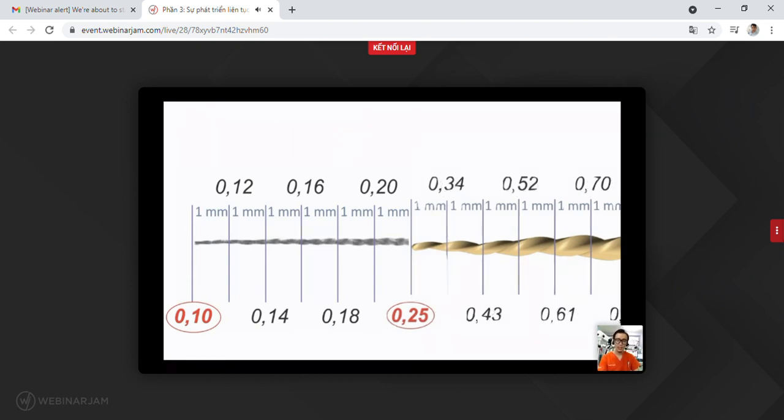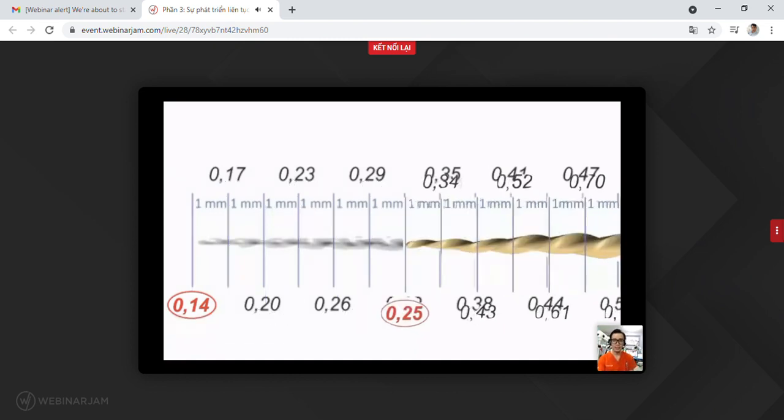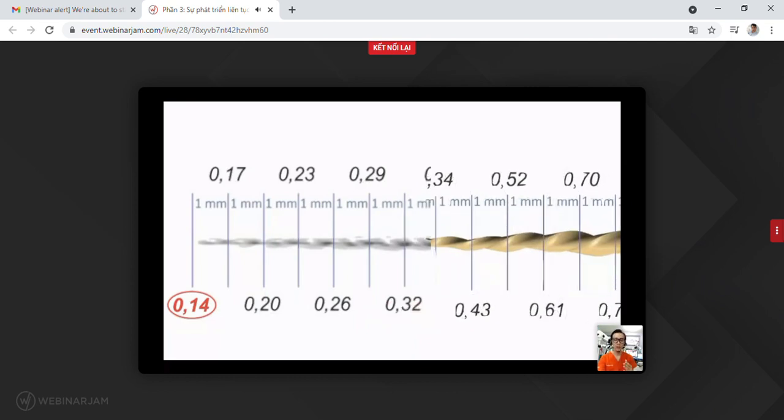That's up to you. And if you are using One Flare, now the root canal diameter will follow what you have prepared with a combination of both K-files and One Flare. And then now you can introduce the 1G file to the apical third of the canal. And then you can sequentially insert the One Curve after gaining this combination of 1G and One Flare. So from this mathematical point of view, we can see that after inserting the 1G file up to the apical third of the canal, and then inserting 5 millimeters of One Flare from the orifice, now we have this particular diameter of the canal.